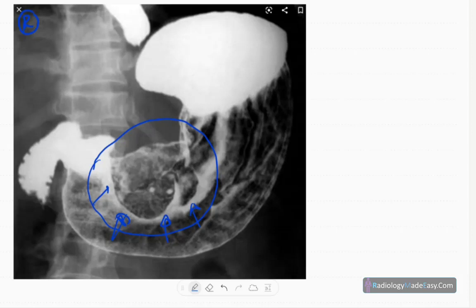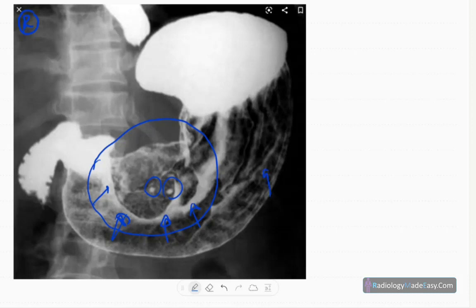However, there are a few ulcerations or contrast-pooled areas. So it's a mass lesion in the lesser curvature of the stomach with some ulcerated areas. It's an aggressive kind of lesion.